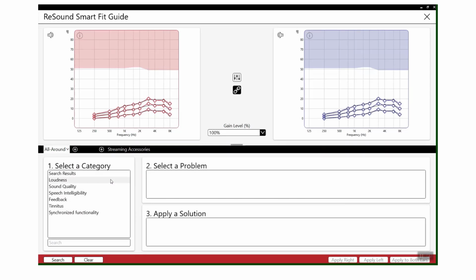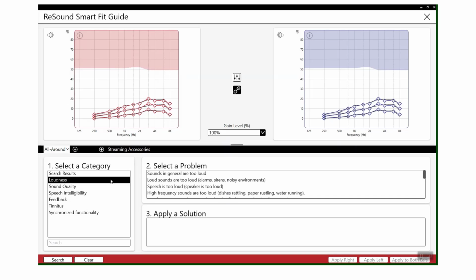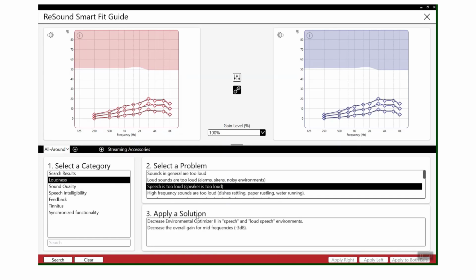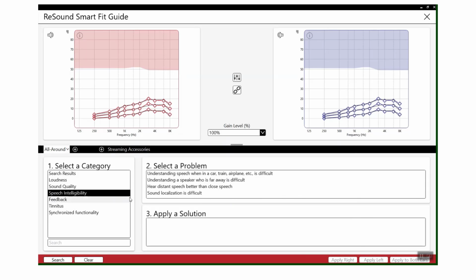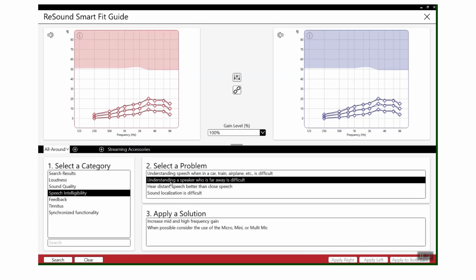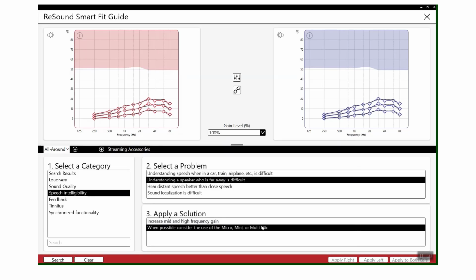For example, loudness. If you've got a patient that's sat in front of you saying that maybe speech is too loud, this will then give you certain solutions that you can pick and apply to both ears, and it will make that adjustment for you without you having to go and find the features. If, for example, you have a speech intelligibility issue, by clicking on a certain problem, it will also advise where appropriate if an accessory should be used. For example, consider the use of a remote microphone.